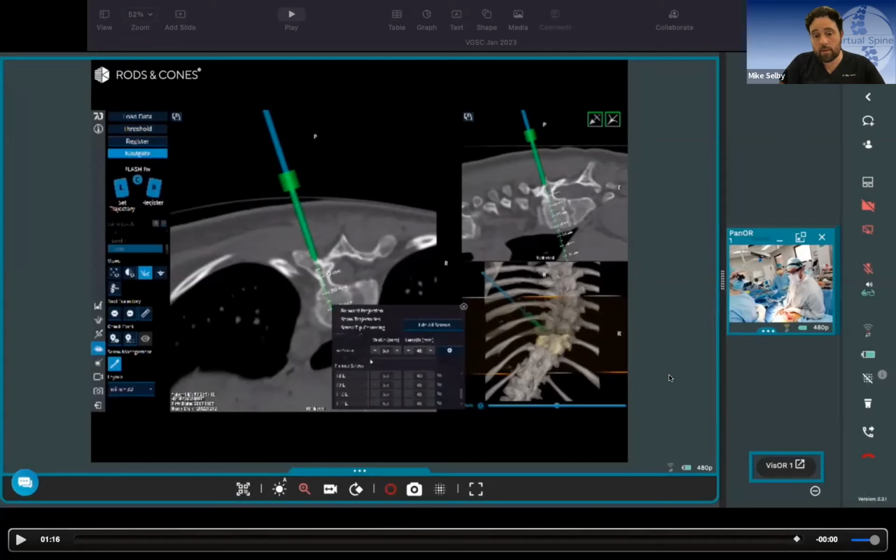That's where it takes a little bit of planning, because seeing the bottom vertebra in this construct, particularly if you preserve the midline ligament, can be a little challenging. So keeping them both linked together, say we were fusing to T12, doing T11 and 12 at the same time does help the system. But if the spine is very mobile, that's where you can run into trouble. And the one you'll run into trouble with is the most distal one, so the very top or bottom of the construct.